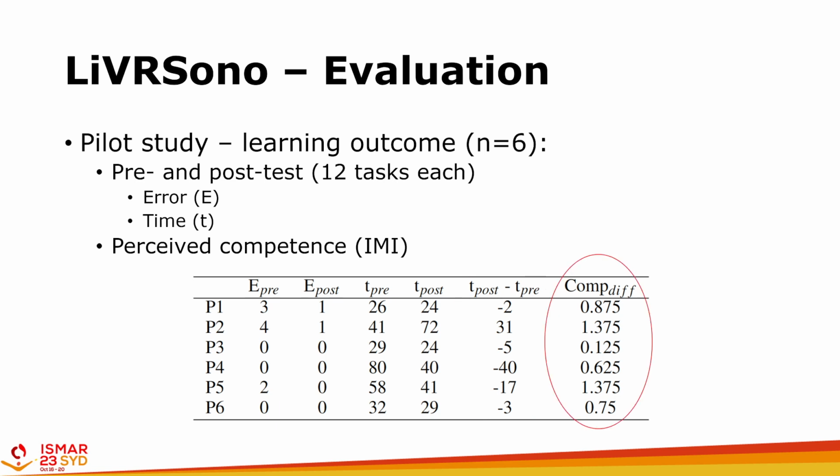The competence also increased from pre to post-test, and additional questions as well as comments emphasized the perceived improvement and perceived learning effect. Despite a ceiling effect as well as limited implication of the study, positive effects are visible, which we want to investigate in future studies.